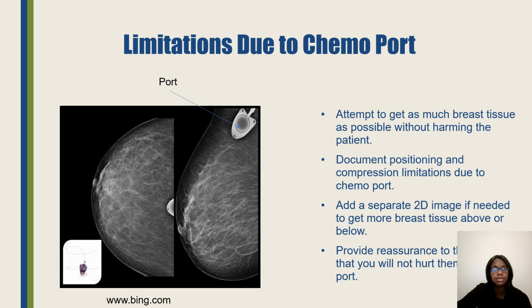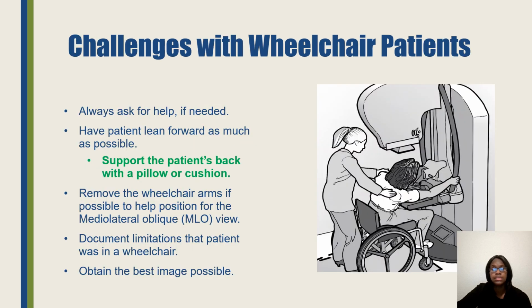You also have this chemo port right here. If a patient has some type of cancer, whether it's breast cancer, liver, or kidney cancer, they will probably have a port, or depending on their treatments, they could have a port placed.